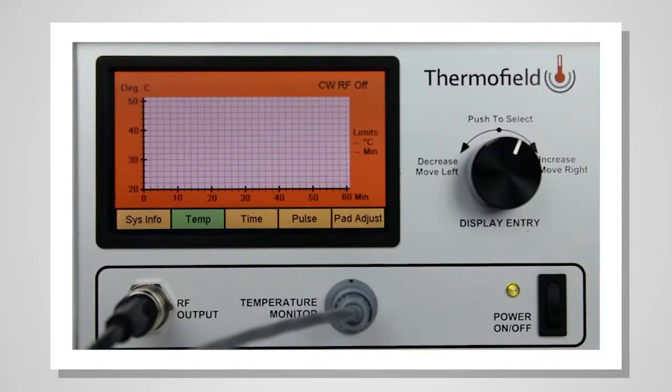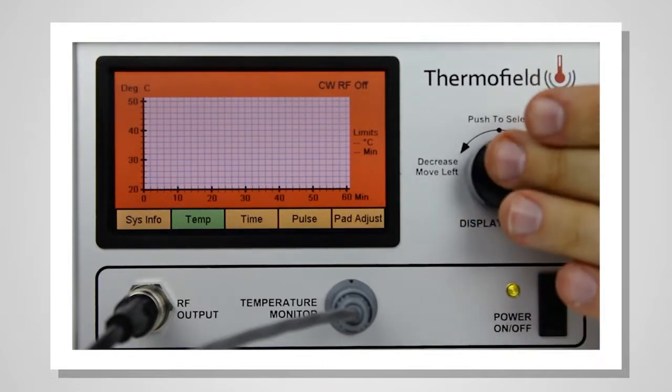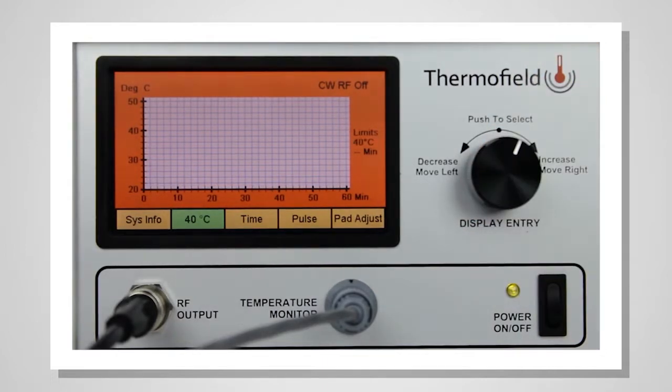The current status of the unit should read CWRF OFF in the upper right-hand corner of the screen. After turning the alarm off, the temp pane will be highlighted in green. Push the display entry knob.